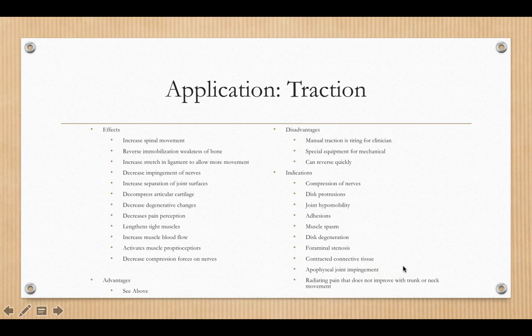So again, finding those in our patient, having a good diagnosis of what's going on is really important for traction to be indicated and for us to want to use it. So you need a really thorough eval. You also ideally want to get x-rays before you do any traction, because we want to make sure that there's no fracture in the area.